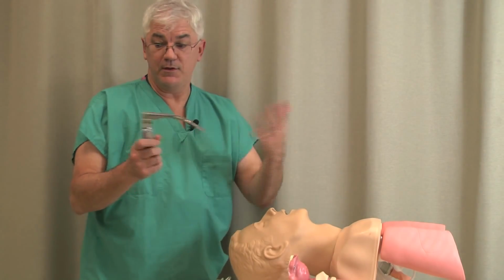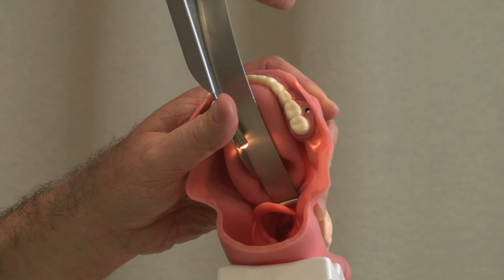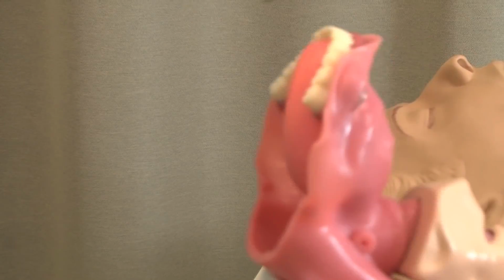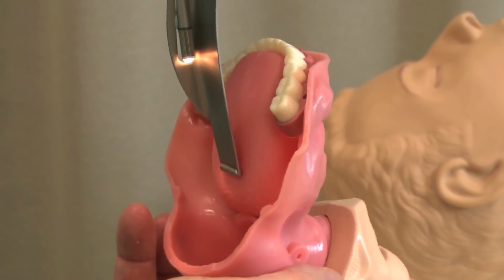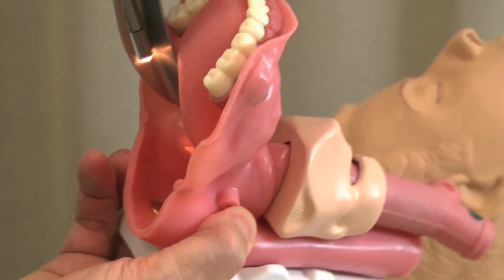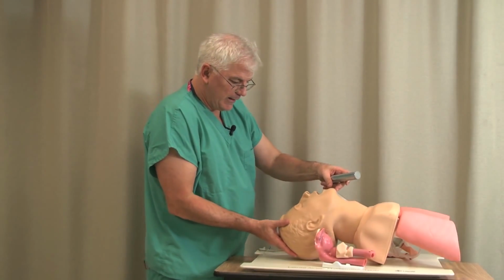Curved blade or straight blade? Well, you can intubate with either. With the curved blade, of course, we're going to go down and lift up in front of the epiglottis. Whereas if we had a straight blade, we would actually lift the epiglottis itself. Now, a mistake so many people make, I'll show you the close-up here, is they really don't get to the side. They sort of stay in the middle. And then when they try to look, see how the tongue will just kind of slide over? The tongue's very wet. And the tongue will slide over, and now you're not getting much of a view at all.